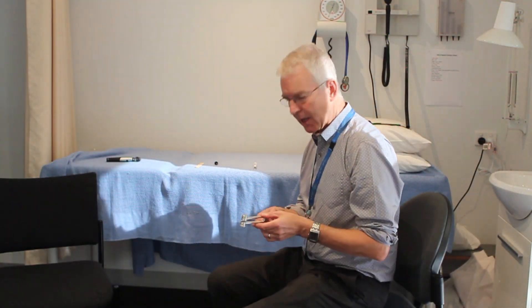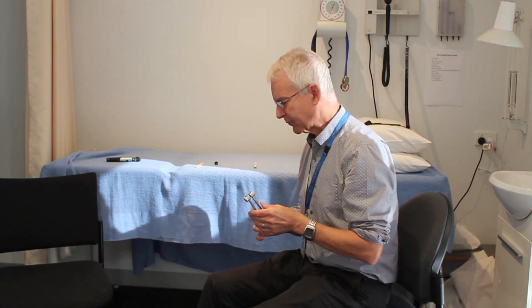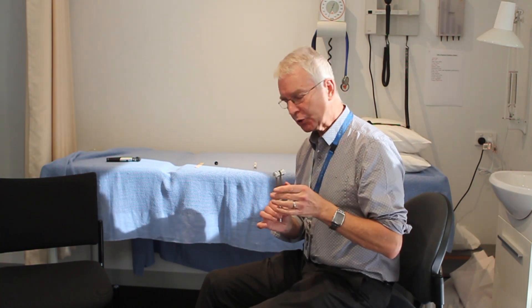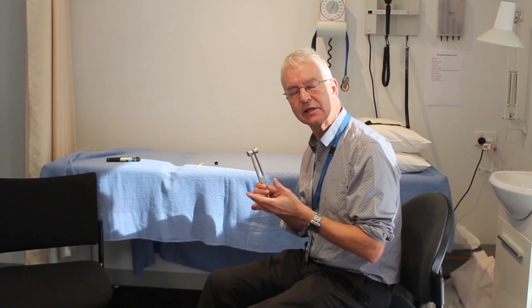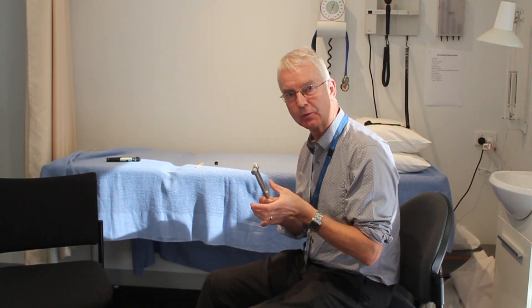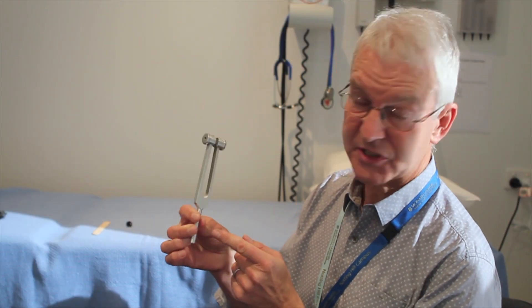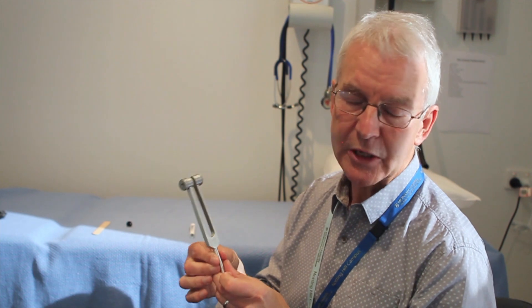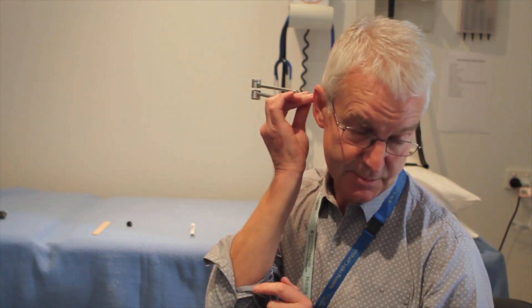To activate the tuning fork, most doctors will hit their knee or their elbow like this. Some doctors prefer to just flick it. But what you should not do is hit it against a hard surface like a table, because that doesn't produce the right volume of vibrations. It's very important to hold the tuning fork by the stem, not touching the vibrating blades. And when you place it for Weber or Rinne, it's the end that gets placed. And just to be clear for Rinne, you're holding the tuning fork with the nearest prong about a centimetre away from the external auditory meatus.